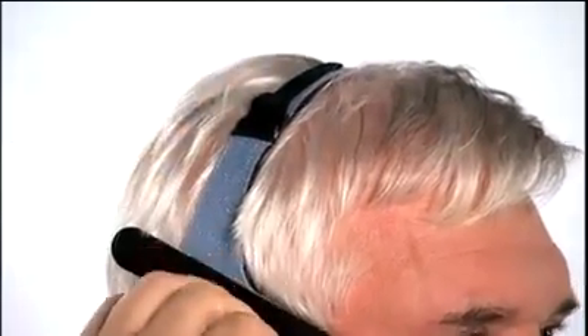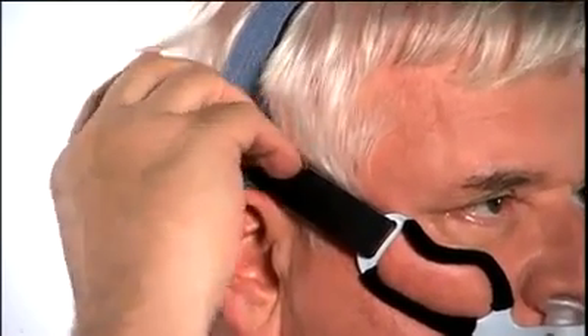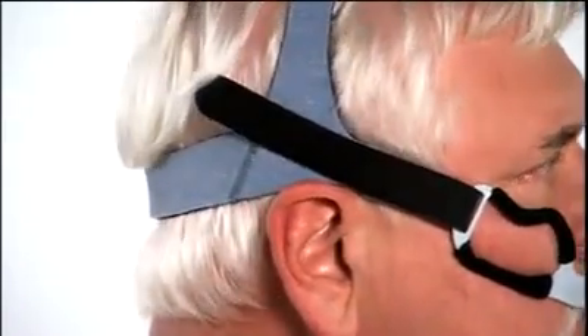The adjustable top strap should rest on the top of your head. The headgear side strap should sit just above the ears, similar to where eyeglasses would rest. Evenly adjust the side straps at the same time by pulling the fasteners off of the headgear and adjusting the length of the straps. Reattach the fasteners when the cushion fits snugly in your nostrils and the mask and headgear feel comfortable.